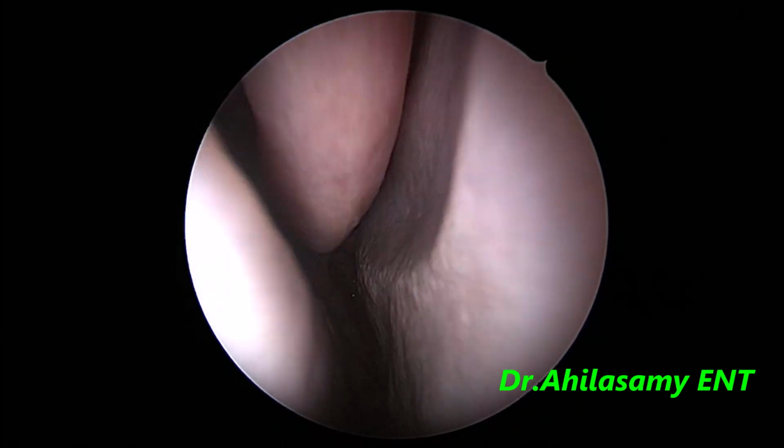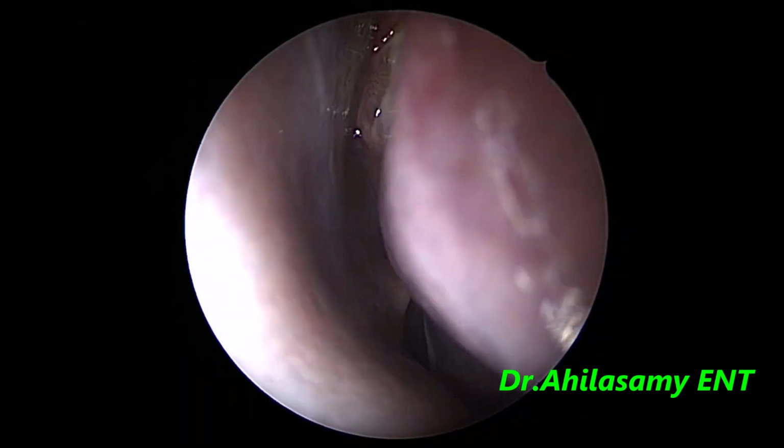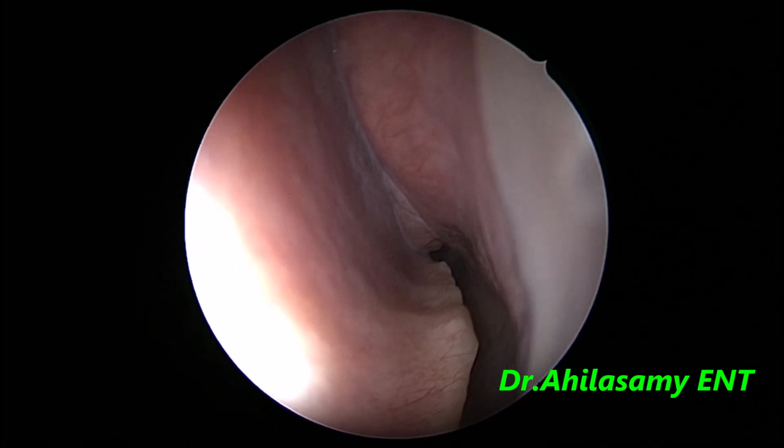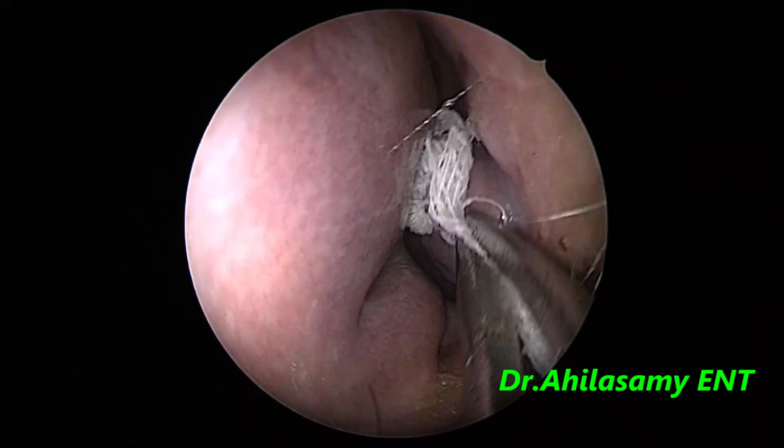This patient has been taken under local anesthesia with a moderate IV sedation. There is hardly any working area, and a big spur in the floor. So we cannot give a sphenopalatine block in this case.